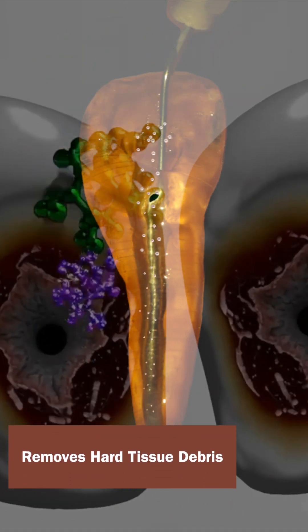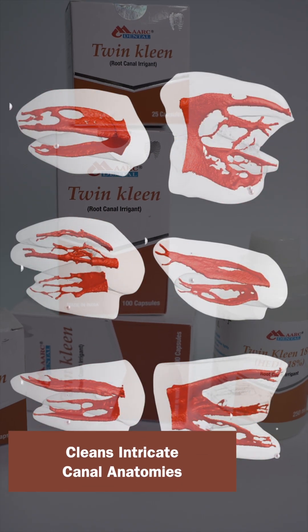It removes accumulated hard tissue debris, prevents smear layer formation, and cleans even the most intricate canal anatomy.